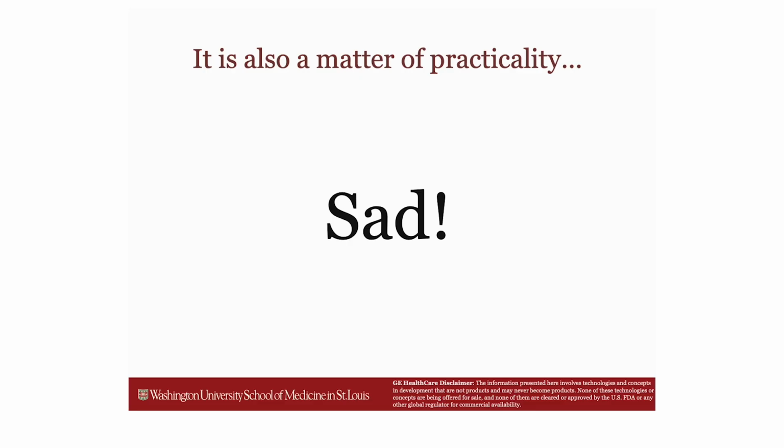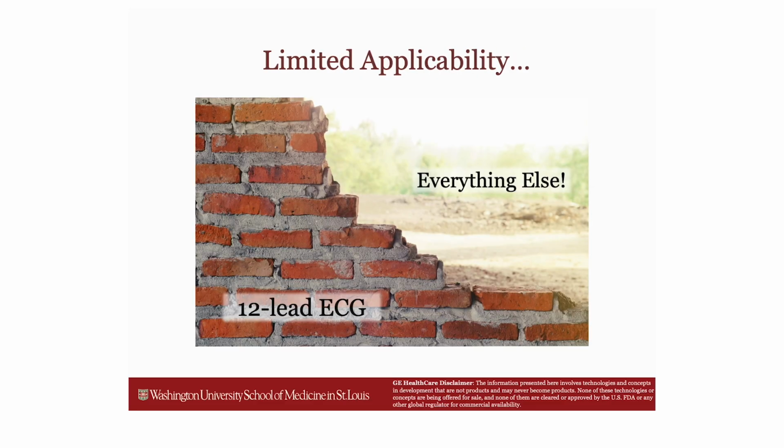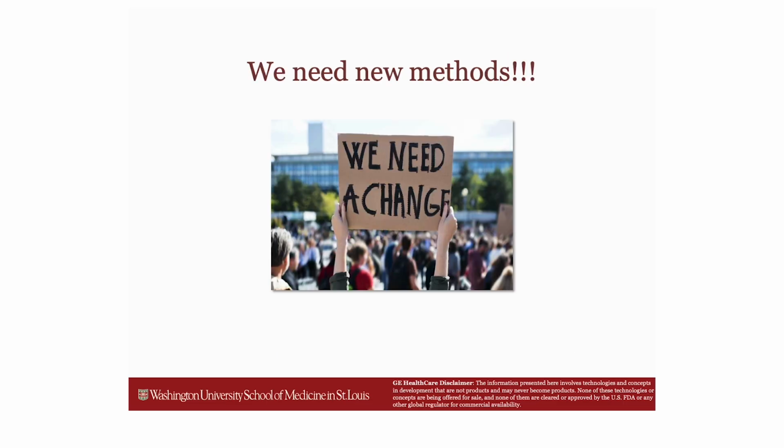It's also a matter of limited applicability. So in addition to manual algorithms being studied on 12-lead ECGs, we really don't have much else to speak of. These algorithms were not tested and developed on remote monitoring devices or systems like cardiac telemetry. So I think it's clear we need new methods.